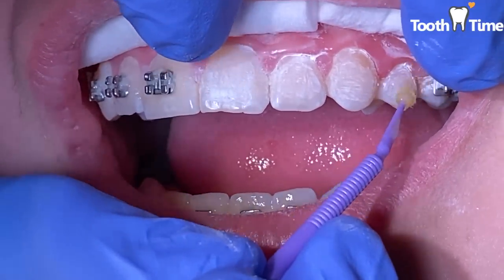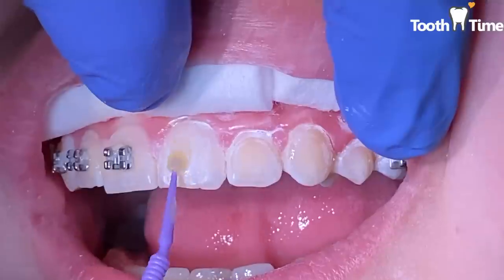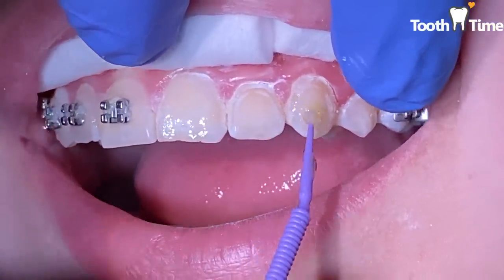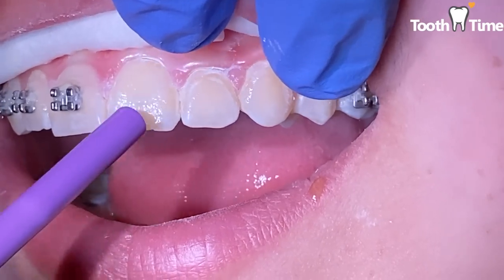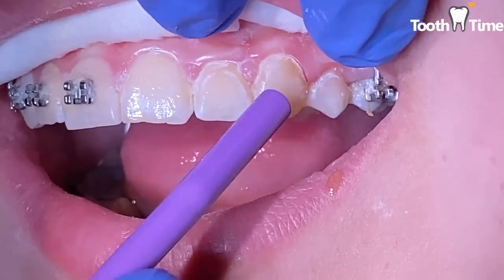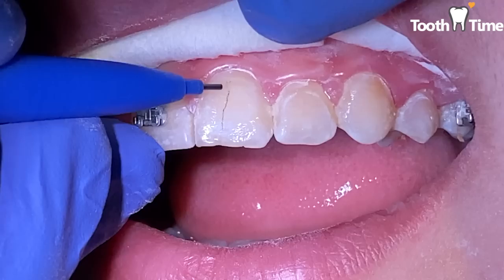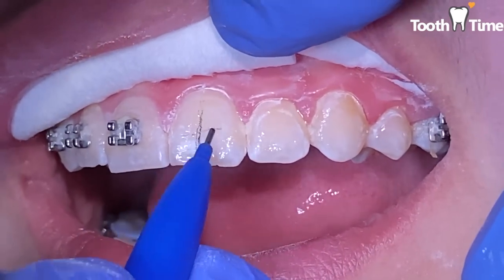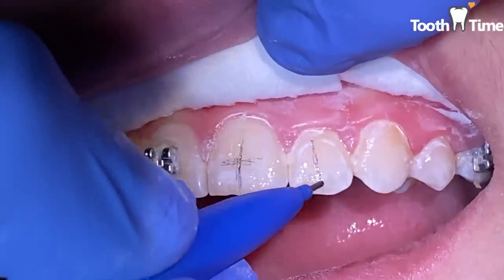The next step is to apply some bonding material to the teeth. The bonding material is part of a series of steps to bonding a bracket — it just helps adhere everything better. We'll place the bonding material, then mark with a pencil where the bracket needs to be positioned, and then place the bracket with our glue and measure the brackets.